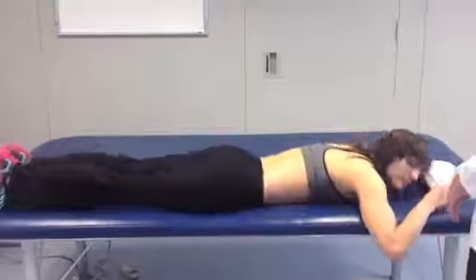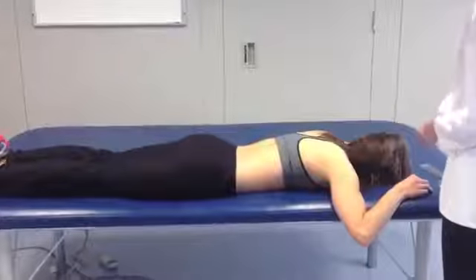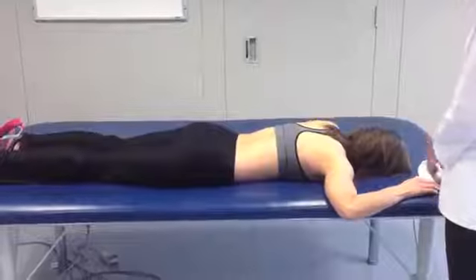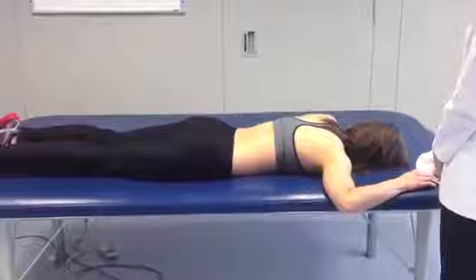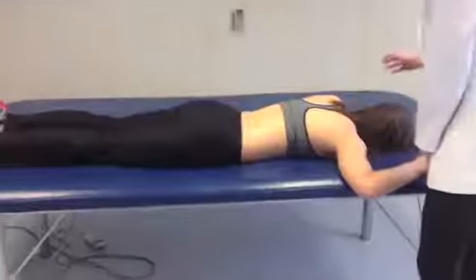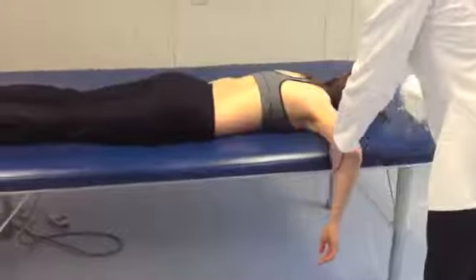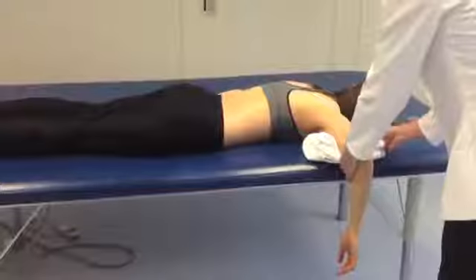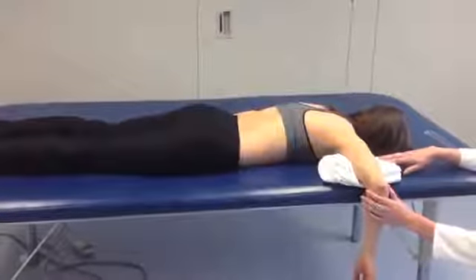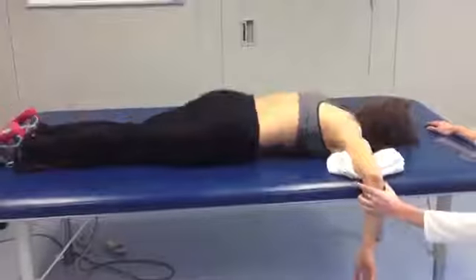Place the patient in prone position, shoulder abducted to 90 degrees, with elbow flexed to 90 degrees. Position a towel under the distal humerus to maintain level arm, and turn their head to the opposite side. I'm going to ask you to keep your head facing that wall. You can bring that arm down to your side. I'm going to keep this arm up so we're making almost an uppercase L. I'm just going to place the towel here to make sure that your arm is level before we start the exam. Can you move just slightly over so that your elbow creases? Yeah, perfect.